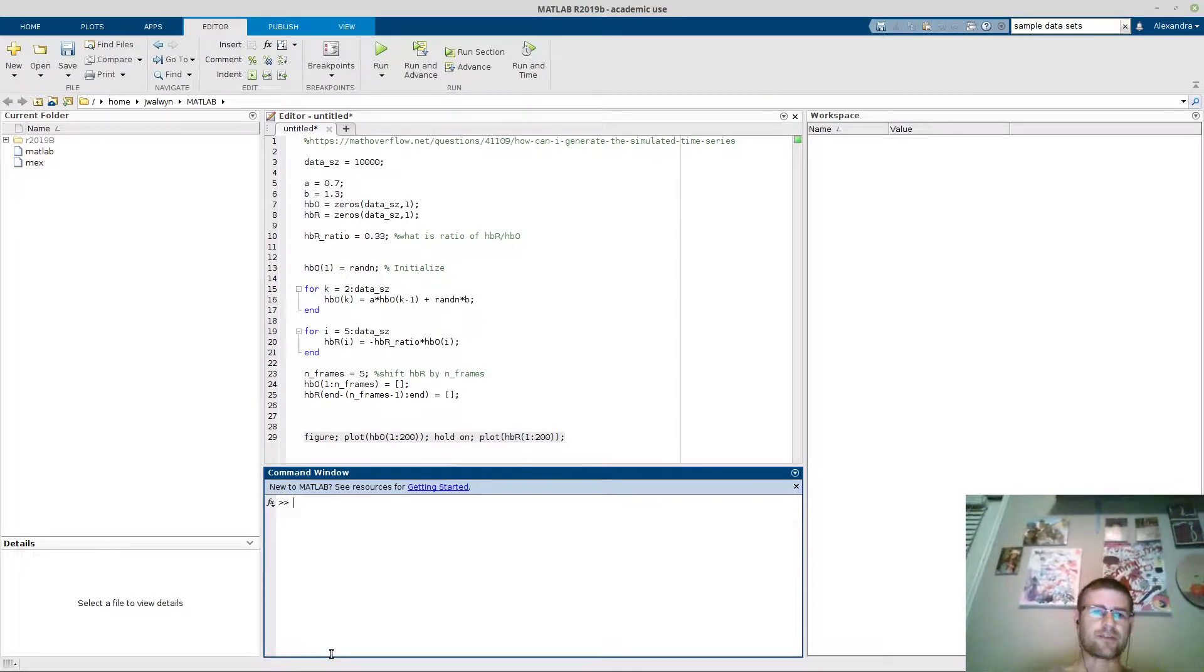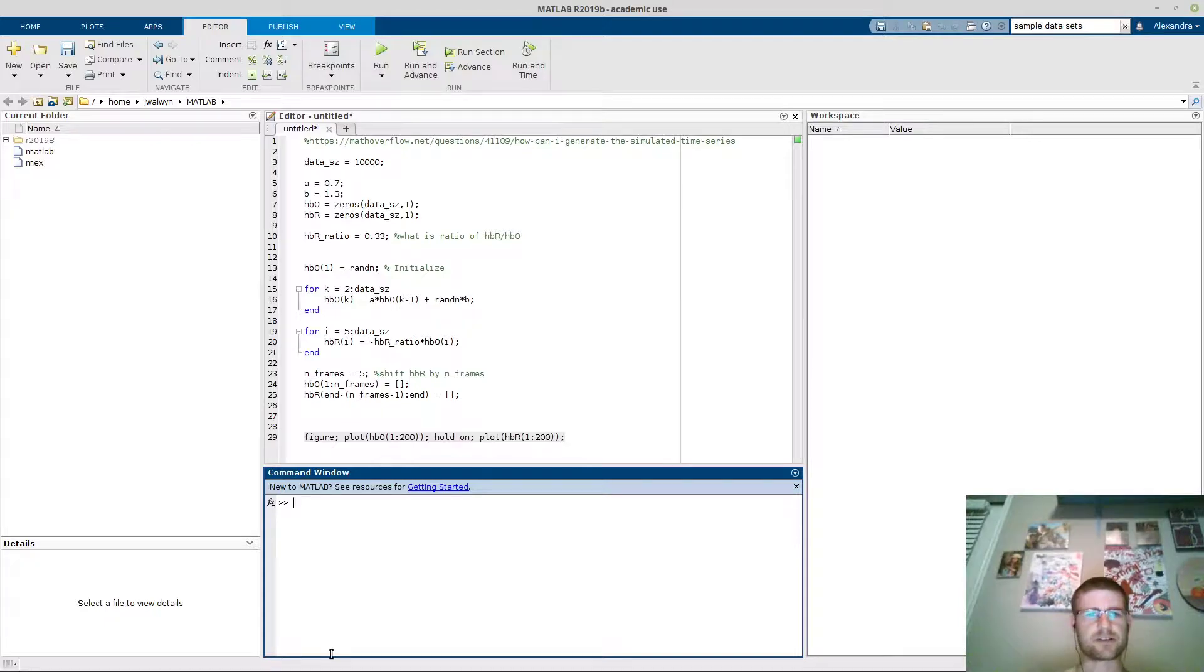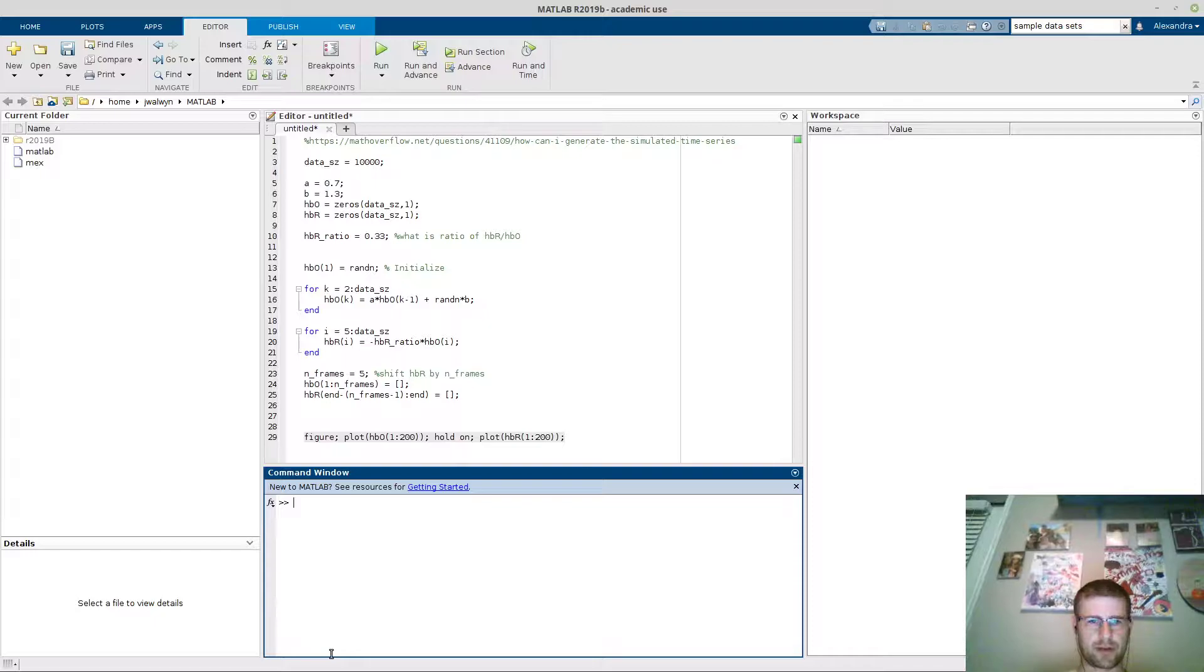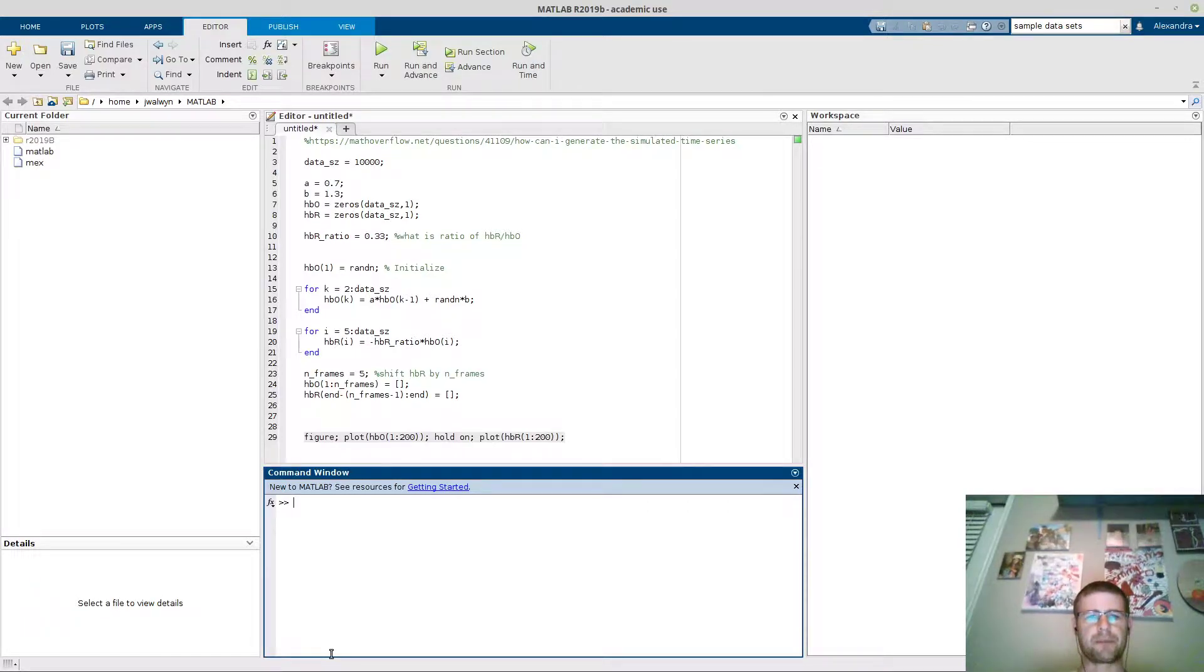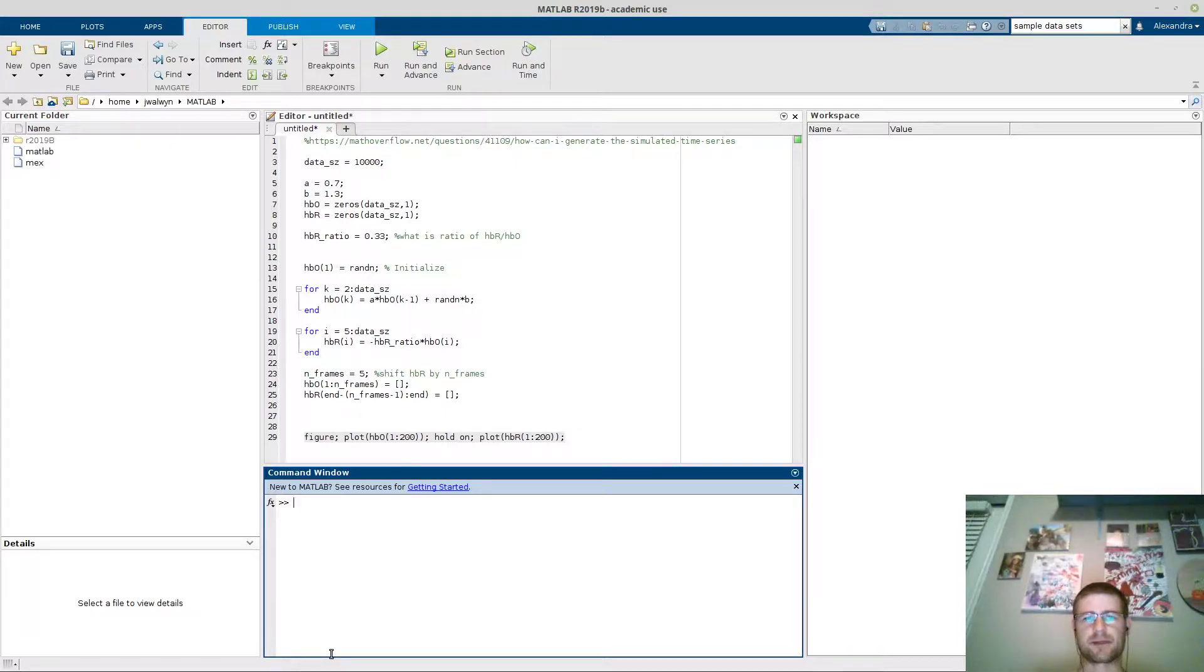Hi everybody, this is a video on how to fabricate some fNIRS data. Admittedly I've stolen a little bit of code from the link at the top of the script here from mathoverflow.net. I modified it quite a bit just to make it fNIRS related, but the previous post was basically about how to simulate a time series.